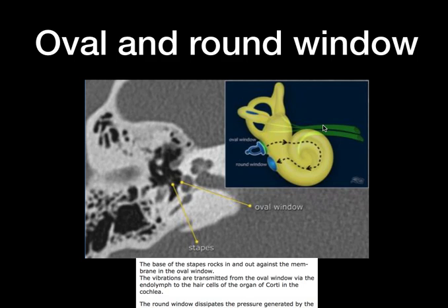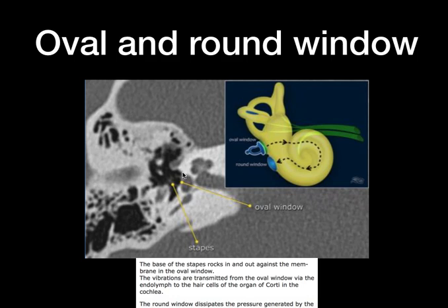Coming to the oval window and round window — you can see the oval window where the footplate of stapes, along with the anterior and posterior limbs, attaches. An important structure to remember when looking at the stapes is the fissula ante fenestrum. Look for lytic or sclerotic areas in this region to rule out otosclerosis. There are various stages of otosclerosis, but the first region to be involved is the fissula ante fenestrum.